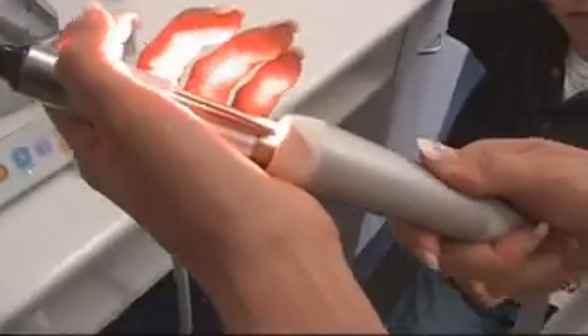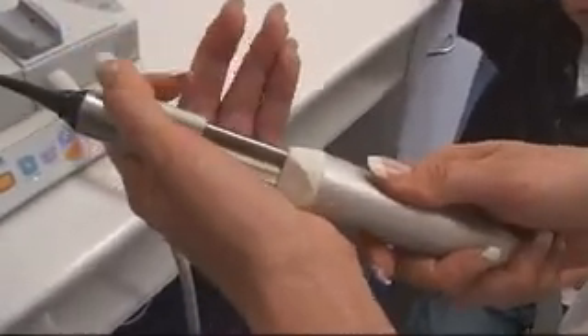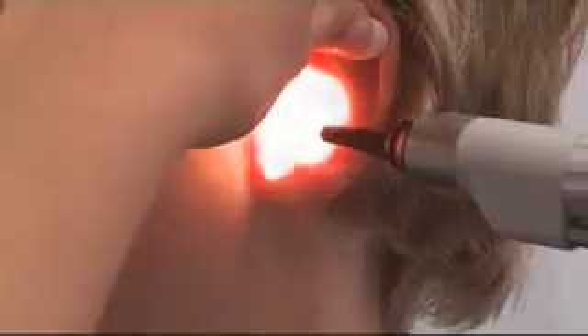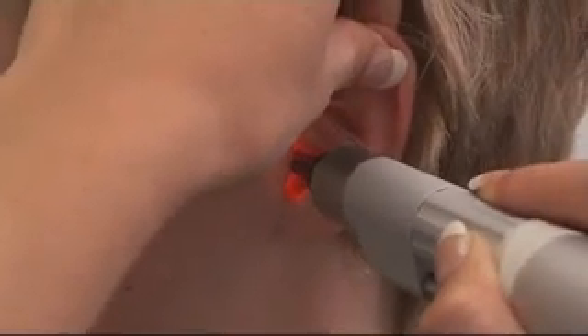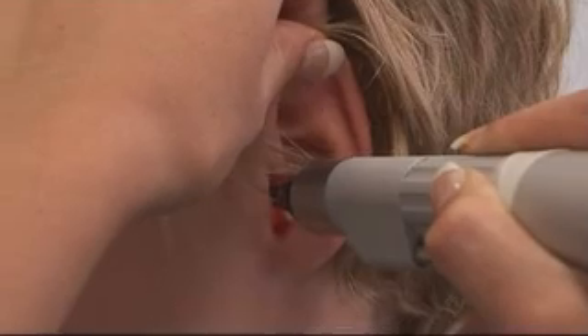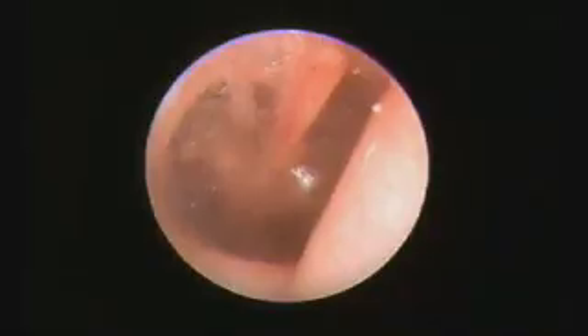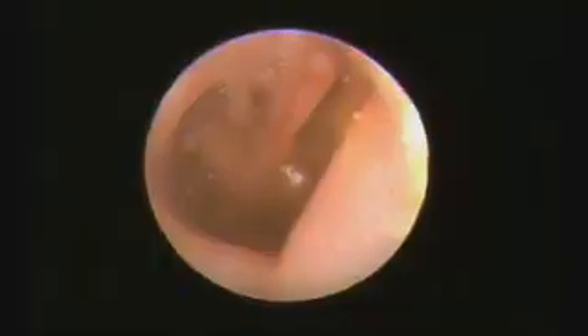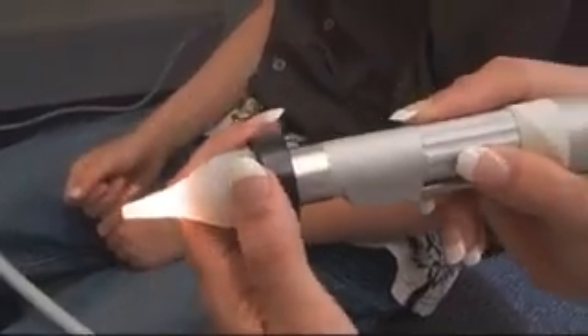The Otoscope Probe can be used to screen for otitis media and general ear infections. It is designed to provide brilliant endoscopic images of both the ear and nasal cavities from small children to adults. The use of disposable speculae guarantees hygiene between patients, and no additional light sources are required as the illumination is supplied through the handpiece. An optional pneumatic seagull speculae is available to confirm movement at the tympanic membrane.